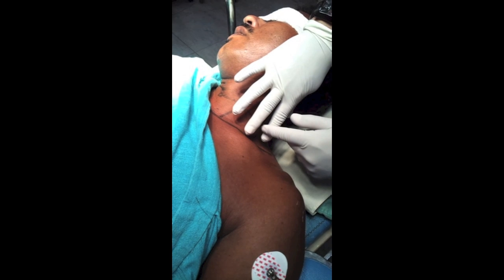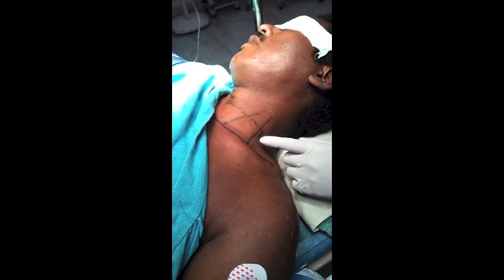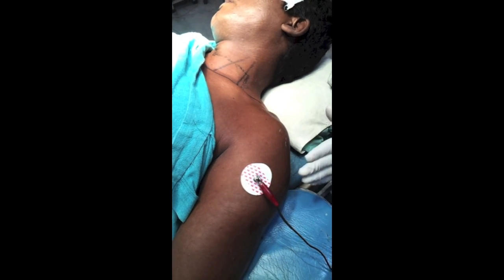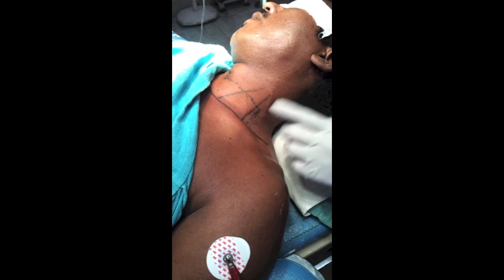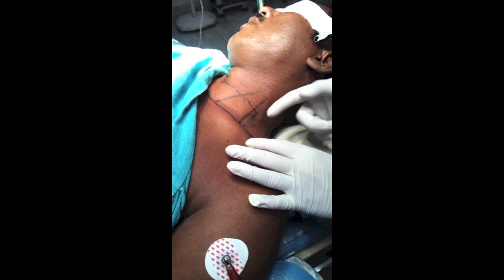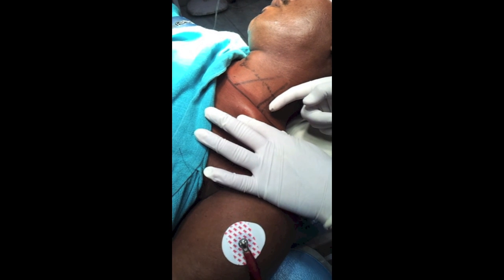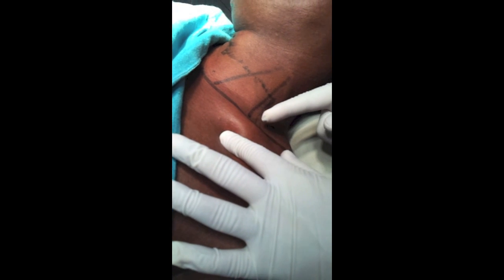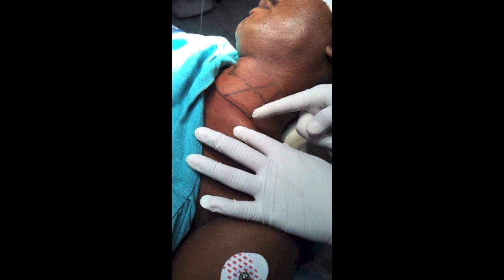You are injecting at the level of the trunk — the most compact part — so any contraction can be taken as an end motor response: contraction of pectoralis major, deltoid, triceps, biceps, forearm movement, or wrist movement at 0.5 milliamps of current. We should not go beyond 3.5 centimeters from the skin point because that is where the lung pleura is. To hit the pleura you would need to go 3.8 to 4 centimeters, so even in obese patients do not go beyond 3.5 centimeters. If no contraction, redirect the needle and reassess your anatomy.